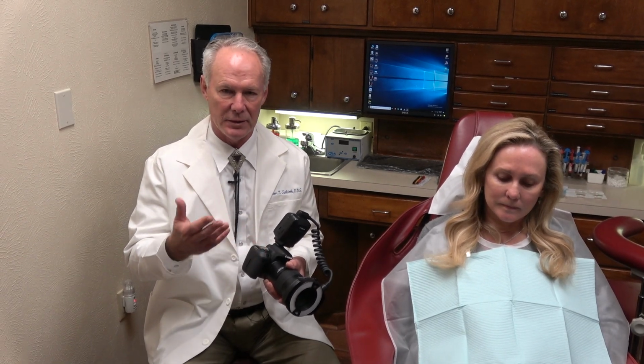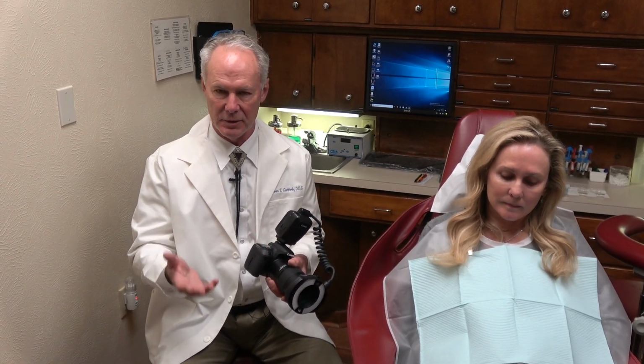Photography is a critical part of a comprehensive dental practice. Too many times dentists are trying to communicate dental treatment and dental conditions with patients verbally. Well, the patient can't understand what you're talking about. So I've always used photography to communicate with patients so that they understand precisely what their dental condition is and what their treatment options are.